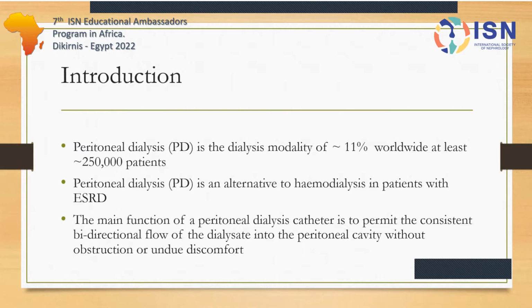The main function of this PD catheter is to allow bidirectional flow of the PD fluid in and out, without causing any obstruction or discomfort to the patient.